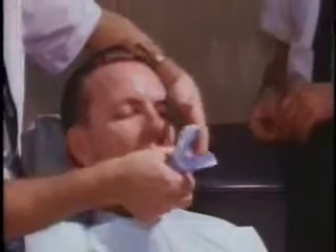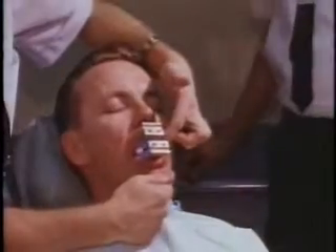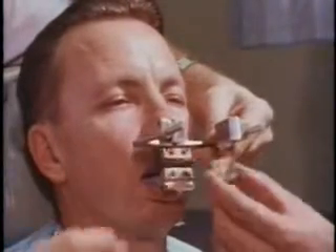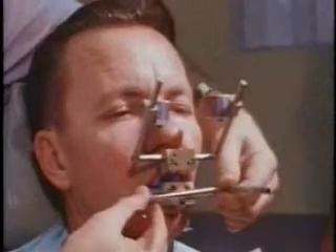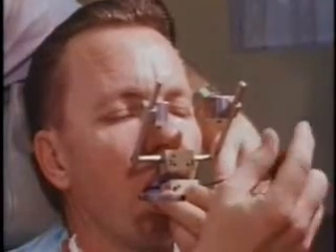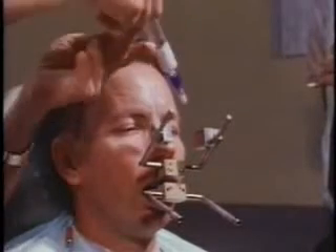The clutches are cemented over the subject's teeth with a zinc oxide and eugenol impression paste. A U-shaped frame is attached to the maxillary clutch to hold the upper recording bow. Note the two attachment cups on the frame. A similar U-shaped frame is joined to the mandibular clutch to attach the lower recording bow. The two cups on the upper frame are filled with quick-setting plaster in preparation for attaching the upper bow to the maxilla.